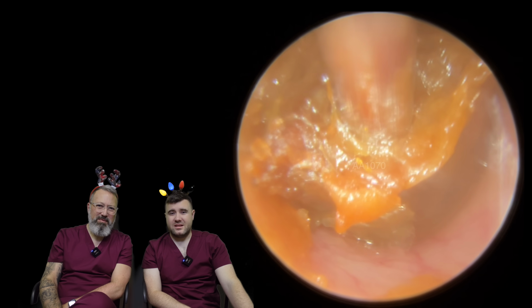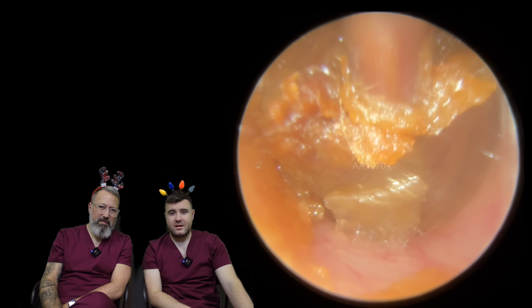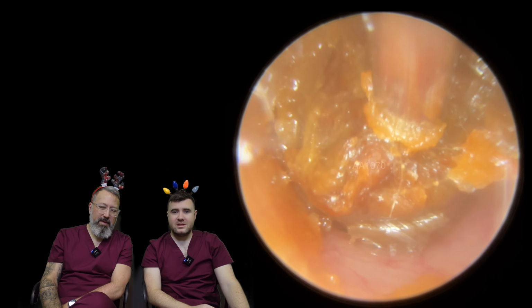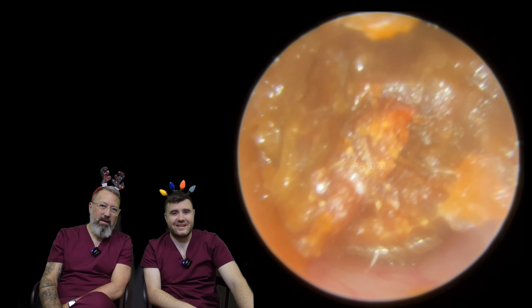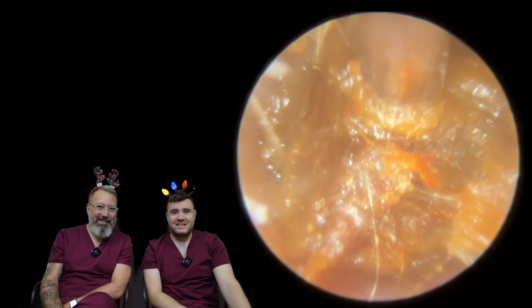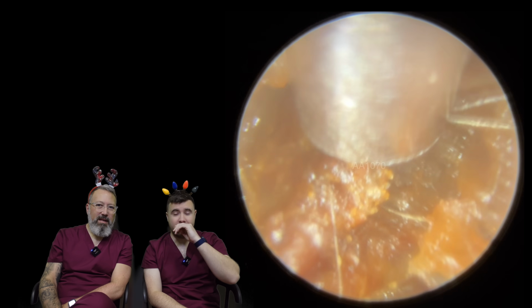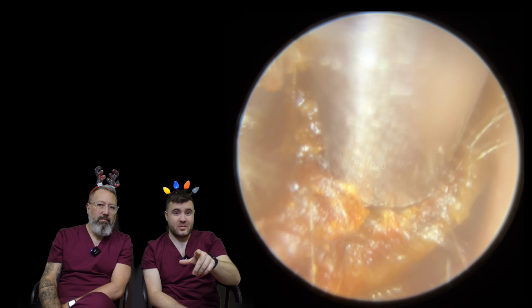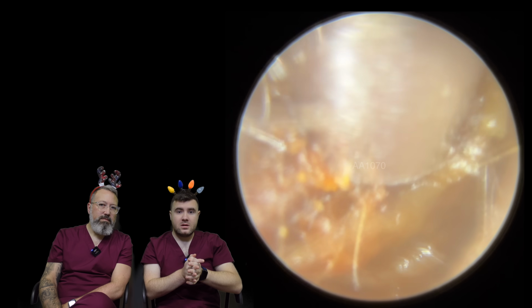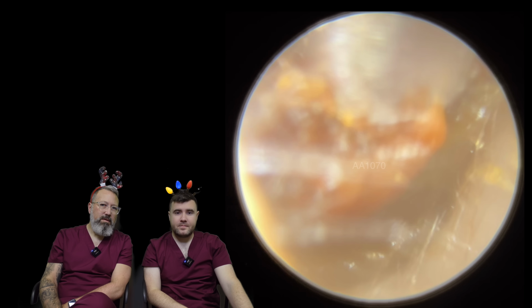Oh, you can see why this was holding on. We just had a massive plug out, and we're still going. This is the one I was thinking of. It just keeps coming. I've taken a plug about this big out, and that's not even a small piece. That's still pretty huge. The patient was actually surprised how much came out. I did have the fine end on there, but I've swapped to the standard tube now that I've loosened it and pulled it forwards, just to try and get a better grip.